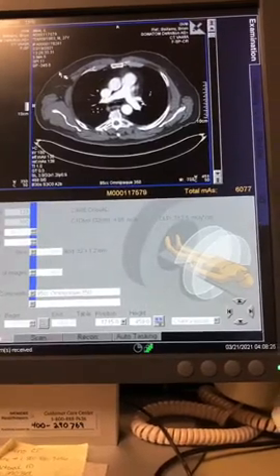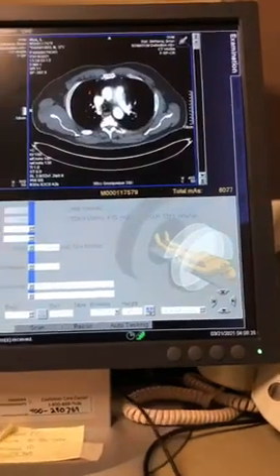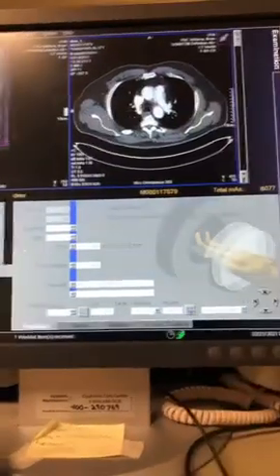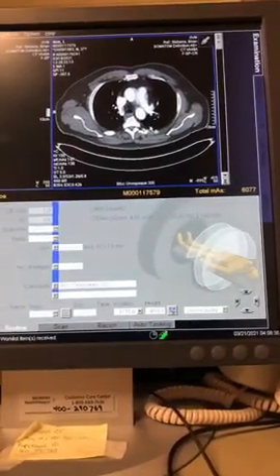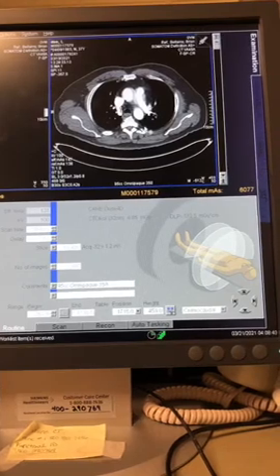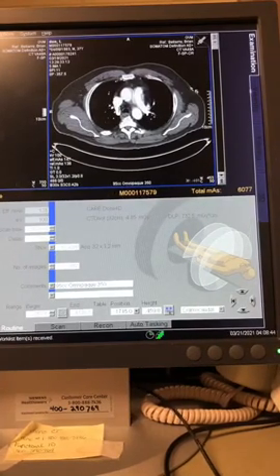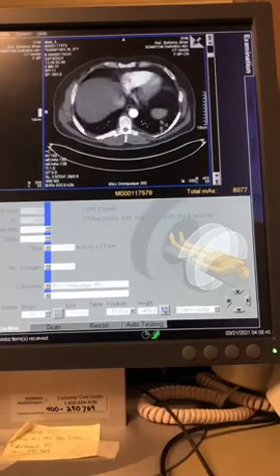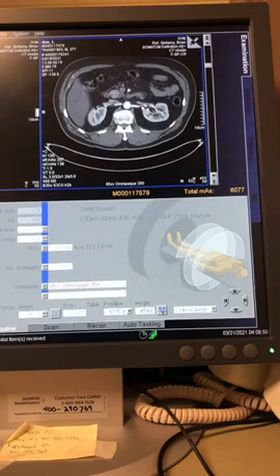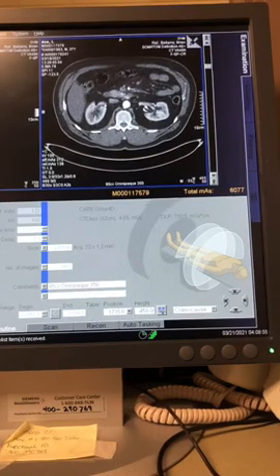All bodies are different. But, all right, so we'll go back to, let's look at the protocols now. So we triggered, we started our scan, we scanned. Remember, this is a CTA chest. We scanned from above the aortic arch, typically down through the renal arteries is where I go for that, which are going to be like, down here somewhere. I'd probably watch my scan and just stop it right there, right? Those are our renal arteries. So I'll get those because you're going to do these pretty little spins when you're done.